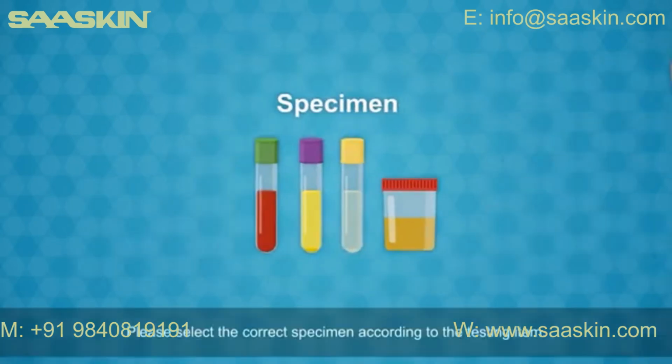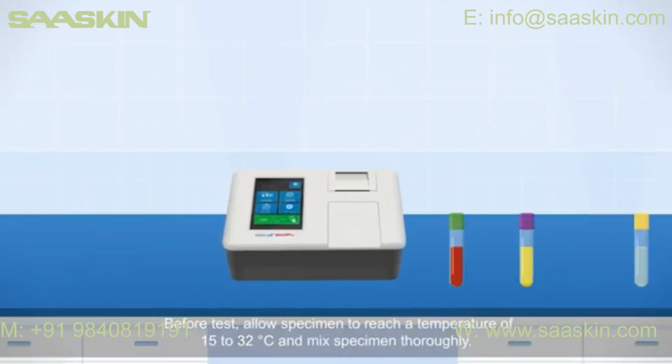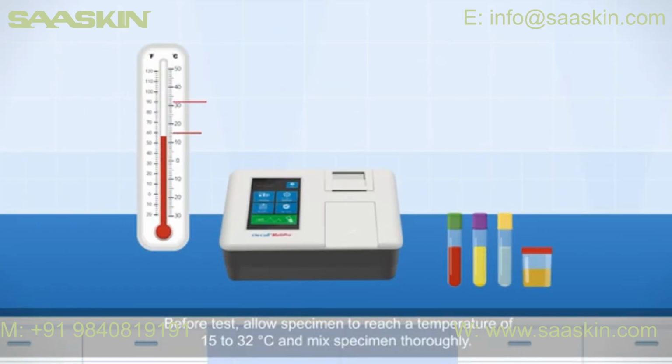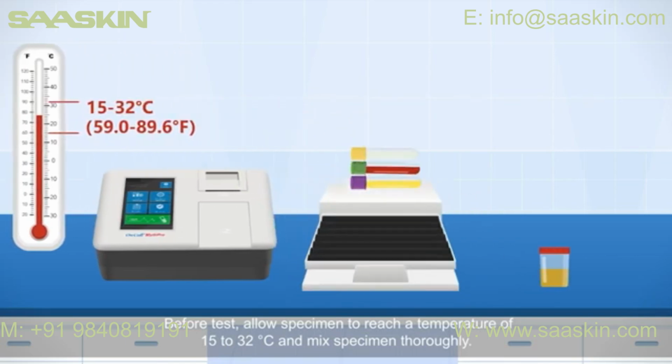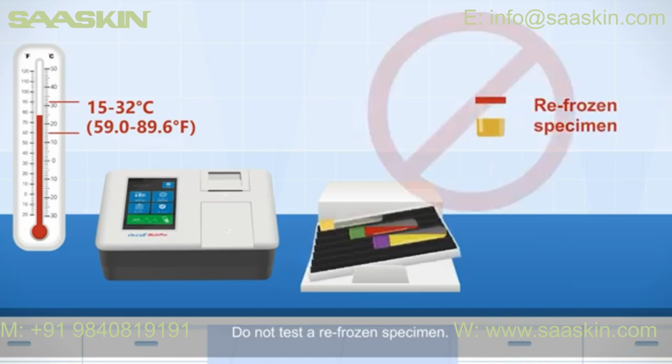Specimen. Specimen types. Please select the correct specimen according to the testing item. Before test, allow specimen to reach a temperature of 15 to 32 degrees Celsius and mix specimen thoroughly. Do not test a re-frozen specimen.